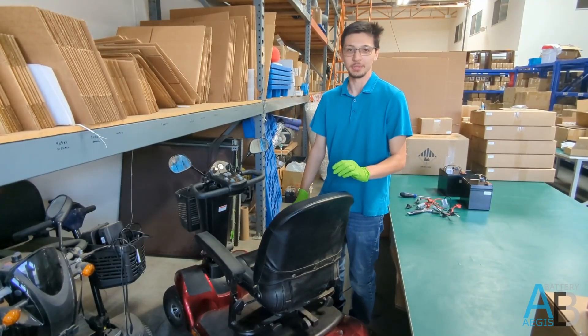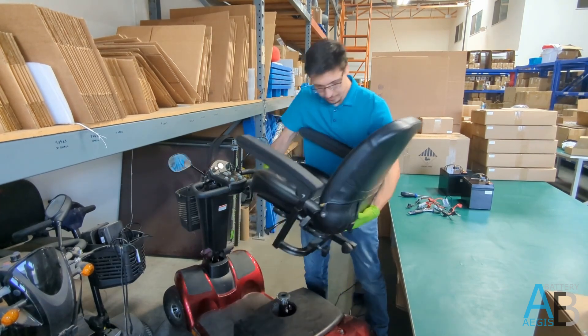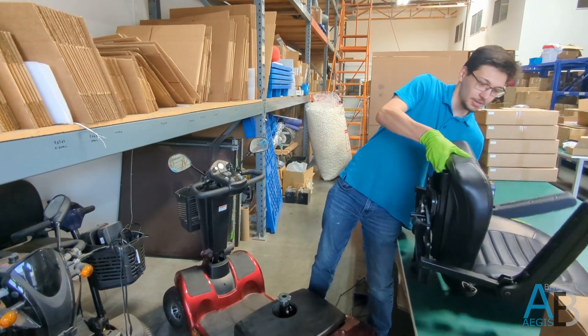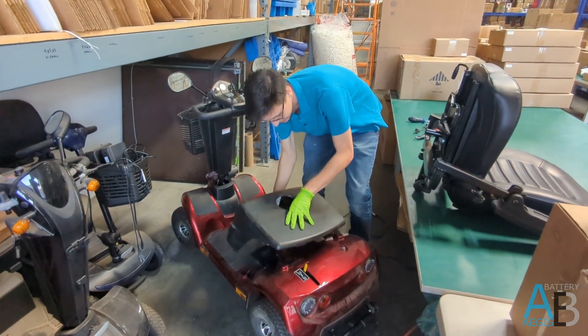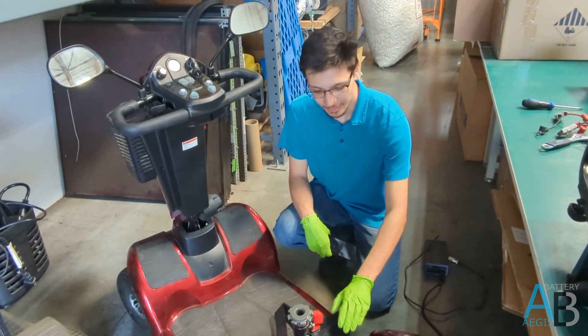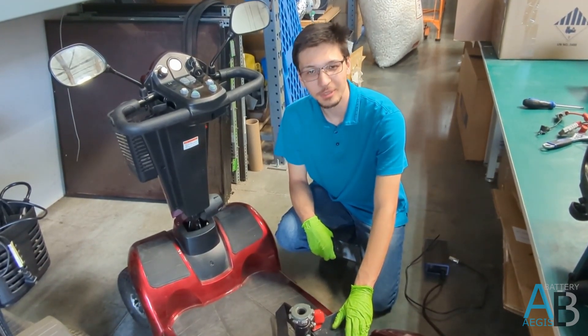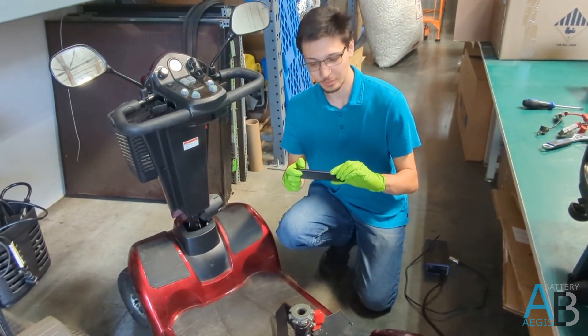For this specific model of mobility scooter, we'll need to remove the chair and the cover underneath it to access the battery. Before removing your old lead acid batteries and installing your new lithium ones, we recommend you take a couple pictures of the original setup for reference later.